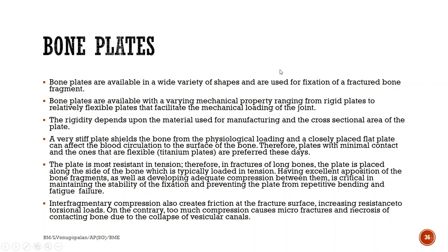Also, if the plate is very closely fixed, if it is rigidly plastered with the bone, then that can affect blood circulation on the surface of the bone, which can again affect the quality, the health of the bone. Therefore, the optimal choice would be a plate with minimal contact and one that is flexible. Titanium plates are very popular because they satisfy these two criteria.